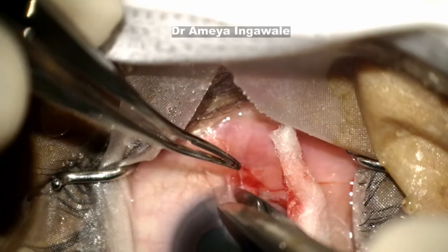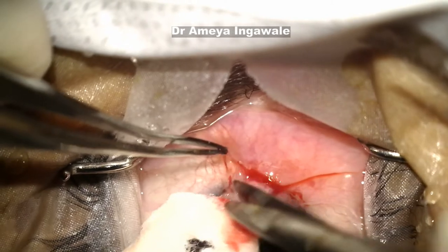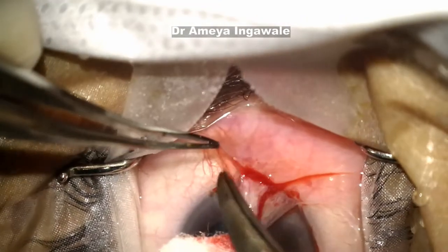The conjunctival incision is taken near the limbal edge. Care is taken not to cut the actual pterygium tissue under the conjunctiva — only the conjunctiva should be cut.